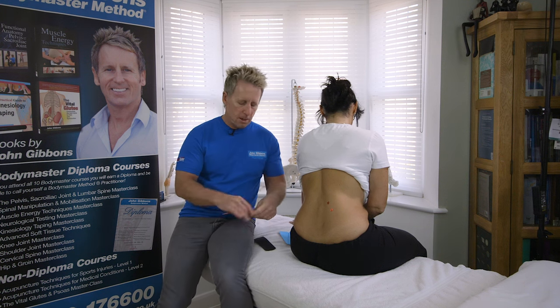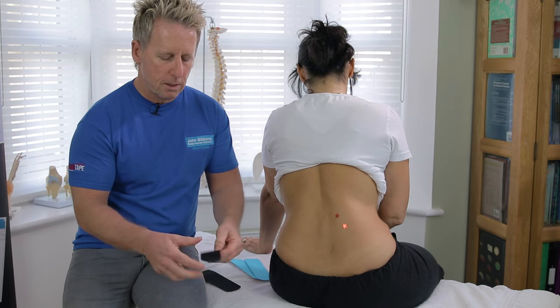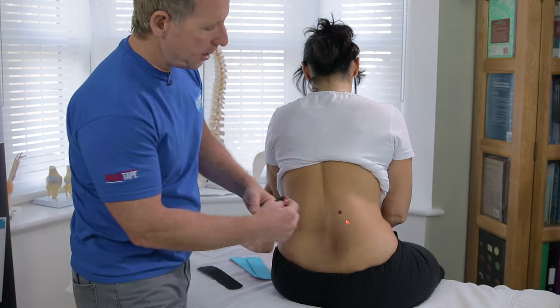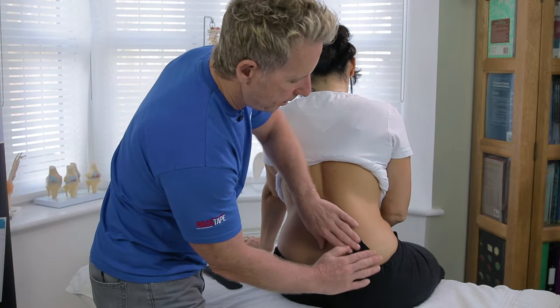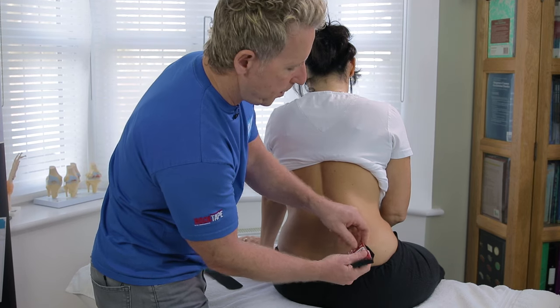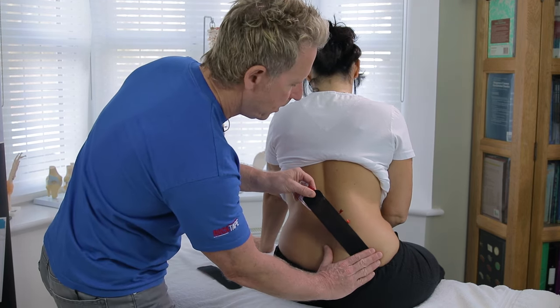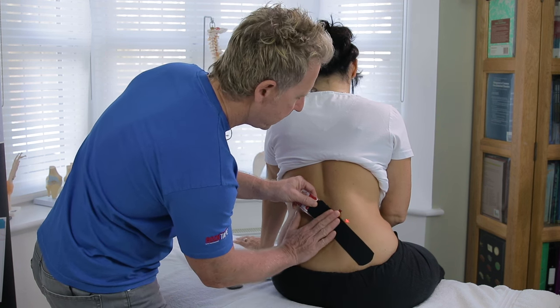First of all, using a small eye strip, I'm going to split the tape at the end and then peel it back. You can keep hold of it rather than peeling it off. I'm going to apply it below the area of pain and apply about 25 to 50% stretch — 100 would be full stretch, 50 would be half, 25 would be a quarter — crossing that area into the lumbar spine.